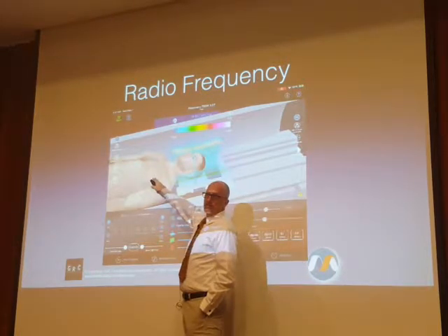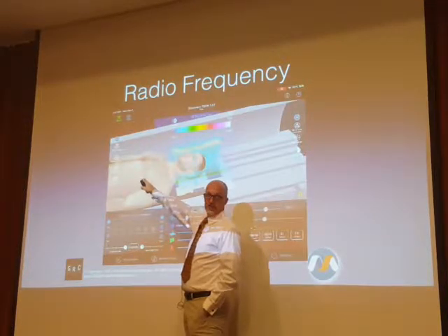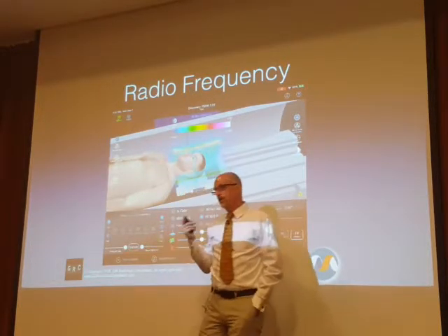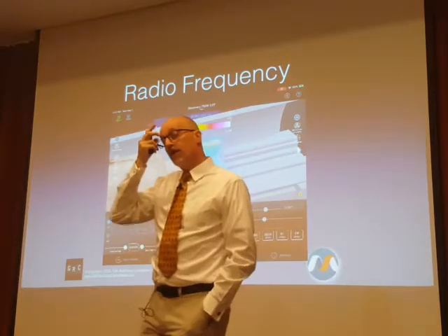How much radiofrequency power is in this patient's thorax? Effectively 0. Transmit-receive head coil, transmit-receive knee coil, transmit-receive foot and ankle coil.